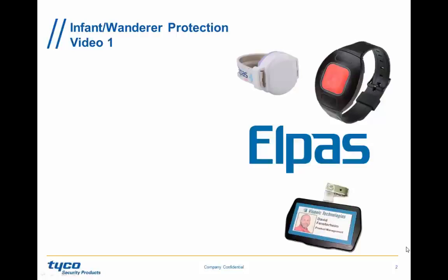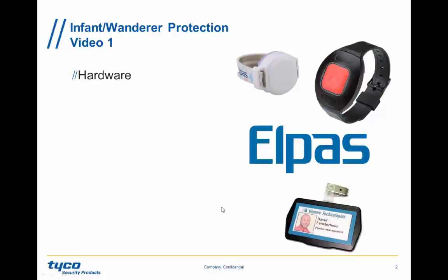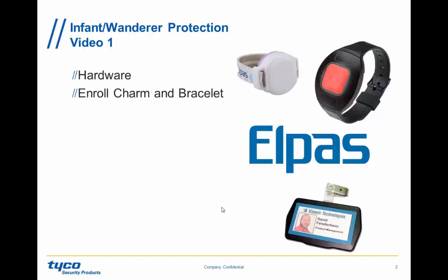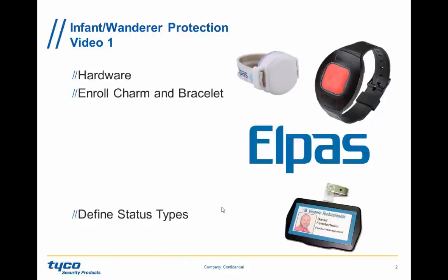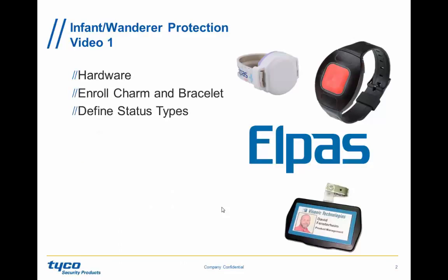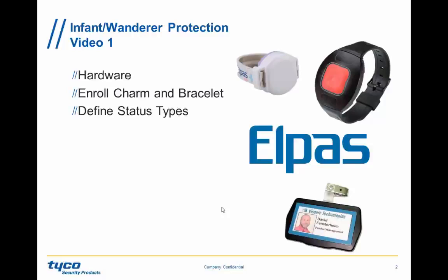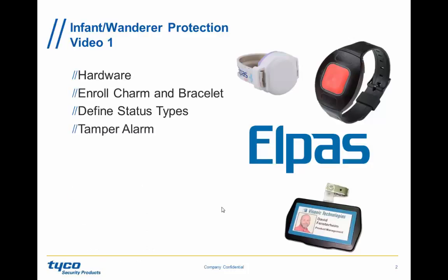In this video, we are going to review the hardware involved. We're going to review how to enroll, how to attach the infant tag, how to assemble the Wanderer band, and learn about the infrastructure hardware, which we've done in previous videos. We're going to define status types in order to arm and disarm and manage the flow of the system. We need to define status types for the tags.